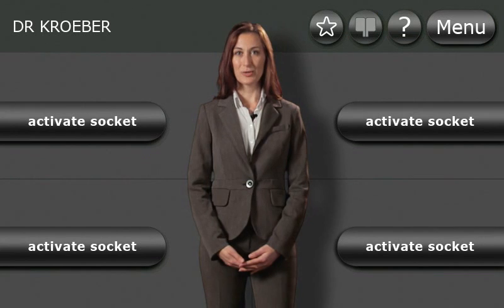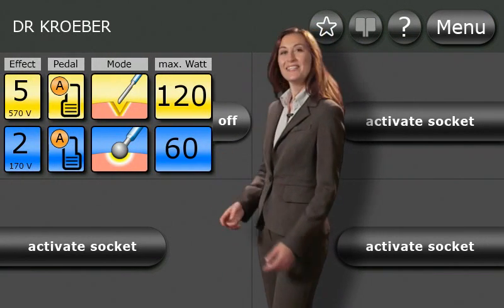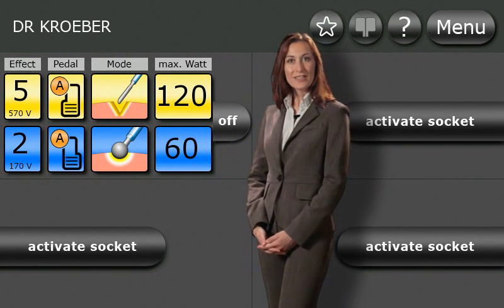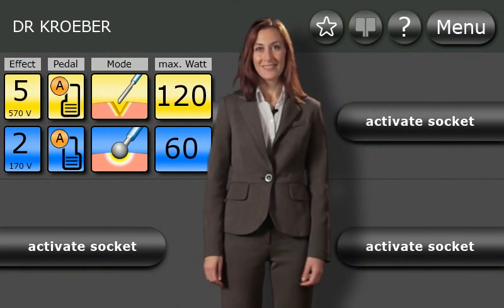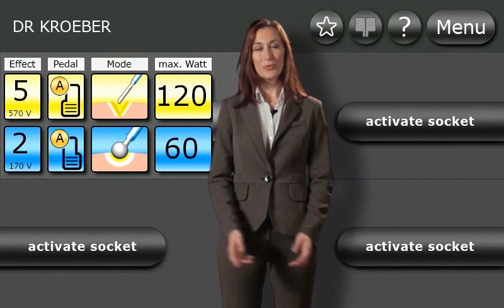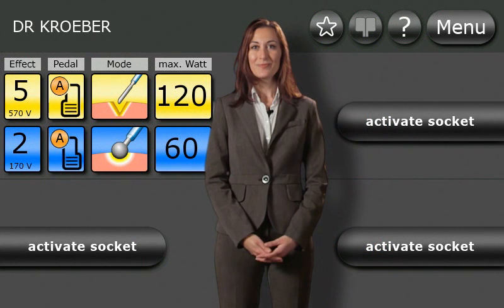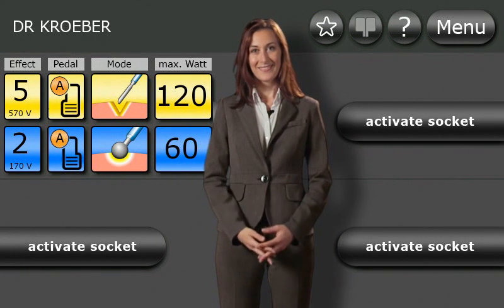As soon as you plug in a connector, for example to this socket at the top, the plug and cut technology detects that an instrument has been plugged in and activates the appropriate selection menu for this socket. Each quadrant of the display is assigned to the appropriate socket, making device operation intuitive. Whenever the settings in a quadrant are changed, the socket for the corresponding instrument starts to flash.